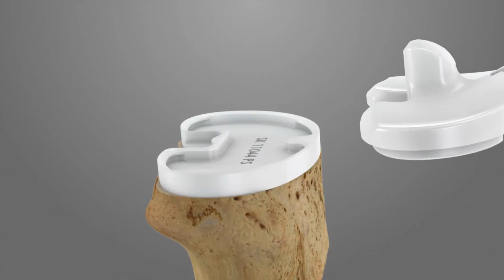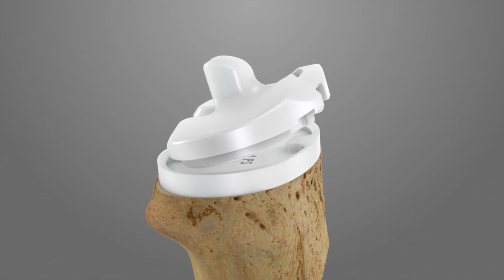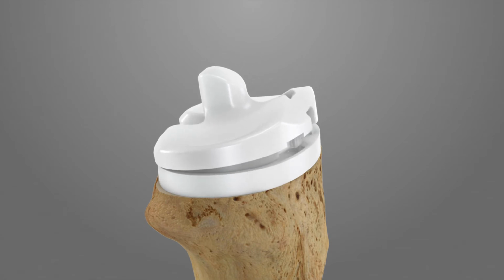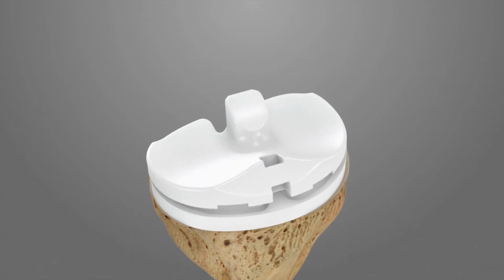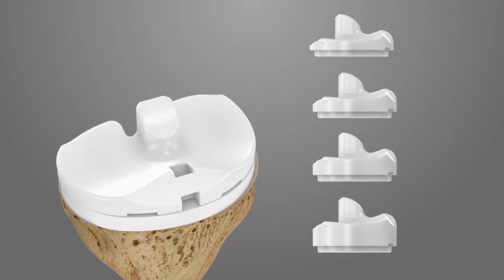Insert the selected trial insert by sliding the trial insert spine underneath the box and up and against the cam mechanism of the femoral trial. Push the trial insert into the tibial tray trial. Rotate the foot to expose the joint space to facilitate insertion. Additional trial inserts are provided with the system.